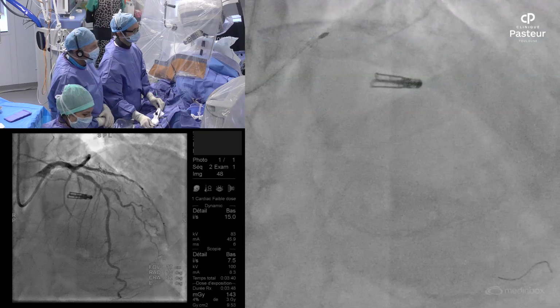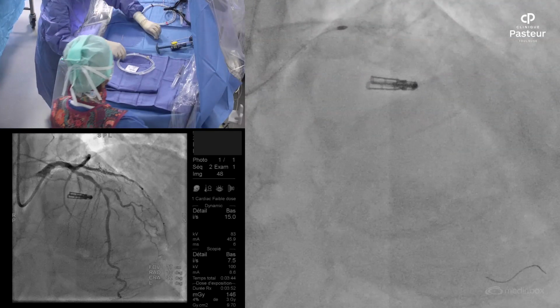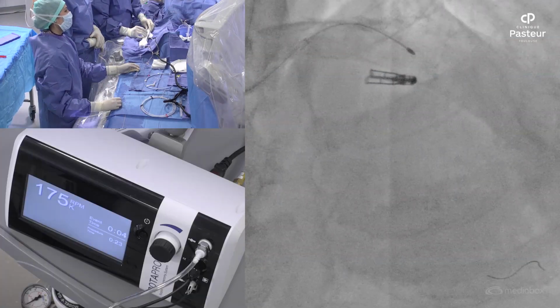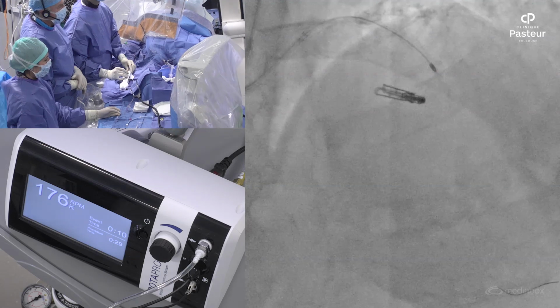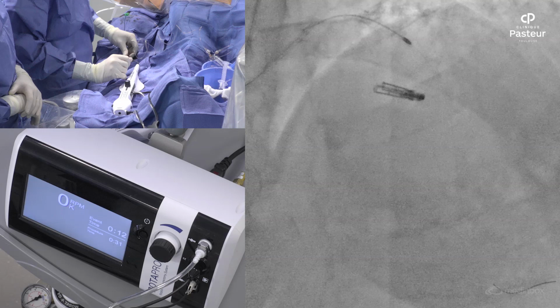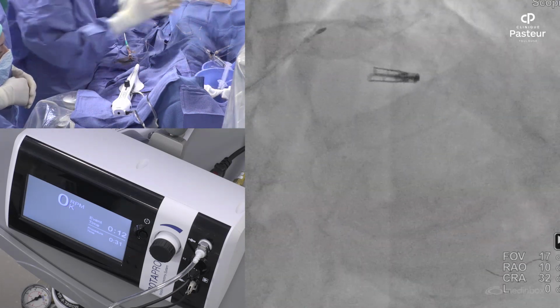It's a perfect demonstration of treating the culprit and then performing reasonably complete revasc before discharge, which offers the patient the best alternative. So you start rotablation. We start rotablation here. You advance very gently the 1.5 millimeter burr. So we just touch for the moment the lesion. We didn't cross for the moment.